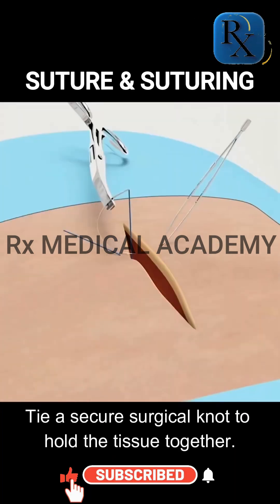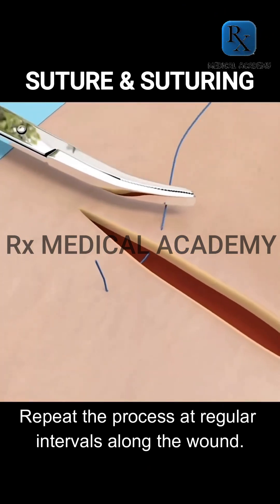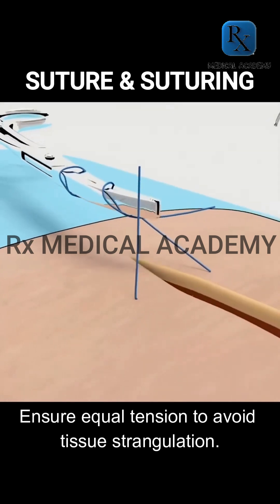Tie a secure surgical knot to hold the tissue together. Repeat the process at regular intervals along the wound, ensuring equal tension to avoid tissue strangulation.